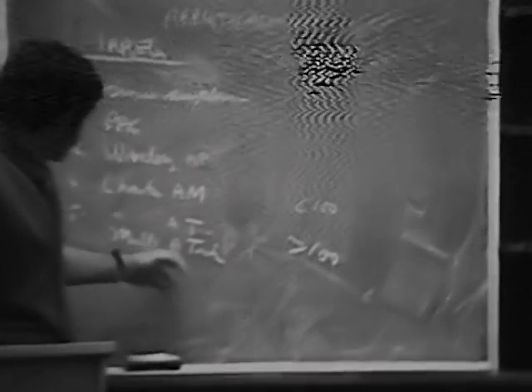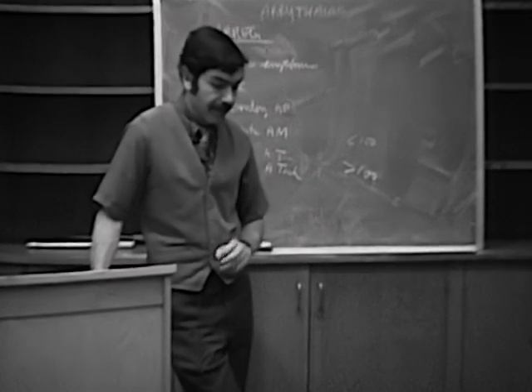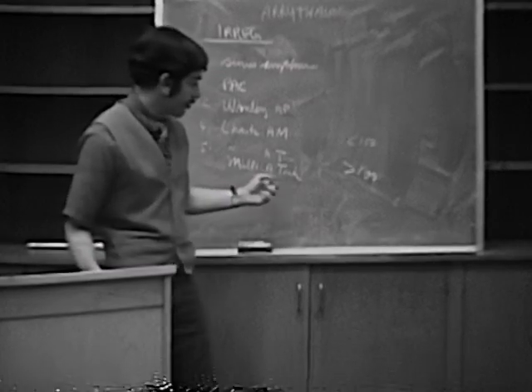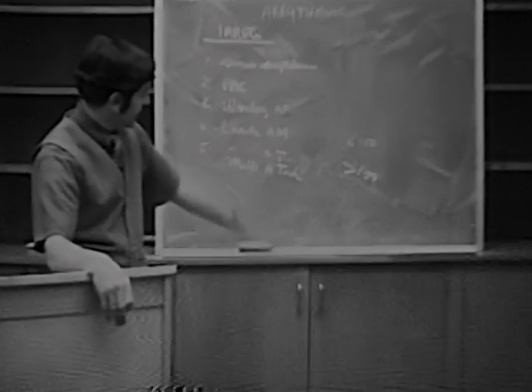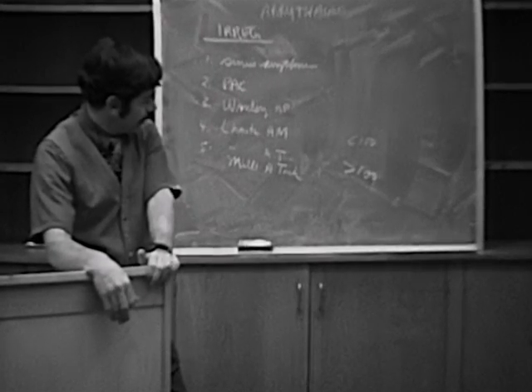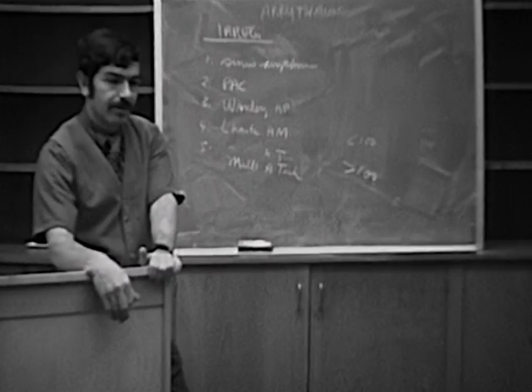Okay. This is usually a very transient phenomenon seen in acutely ill patients. In other words, patients that are just about ready to go into atrial fibrillation for a few hours or days, then they go into this type of mechanism. And as they're going out of it, again, they may transiently go into this type of mechanism. Right? And it's usually associated with acutely ill patients. The important thing about this is to treat the underlying cause. Don't give them digitalis. Digitalis can be dangerous in these patients.